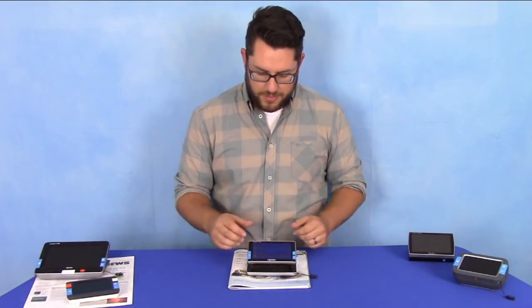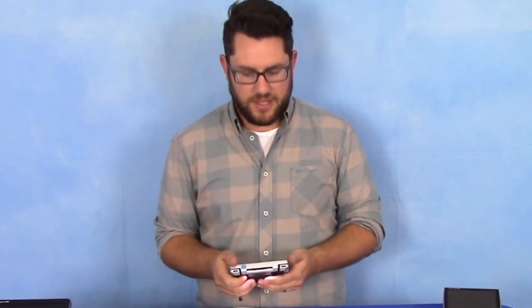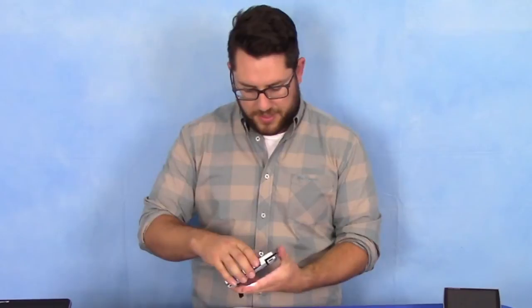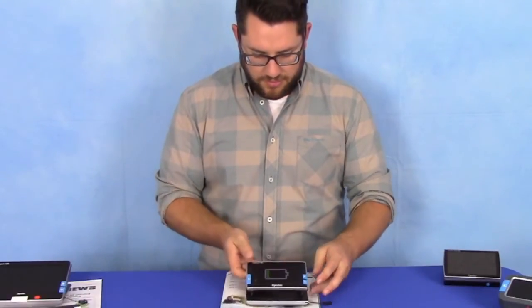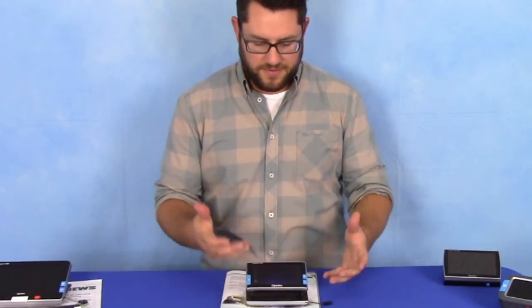The cool thing about this is I can close it, it'll automatically shut off, and I can take it and put it in my bag, in your purse, take it in the car, on the go — whatever the case is. And then as I open it up again, it remembers exactly where I left off: my preferred reading mode, my magnification level, and I can pick up exactly where I left off.